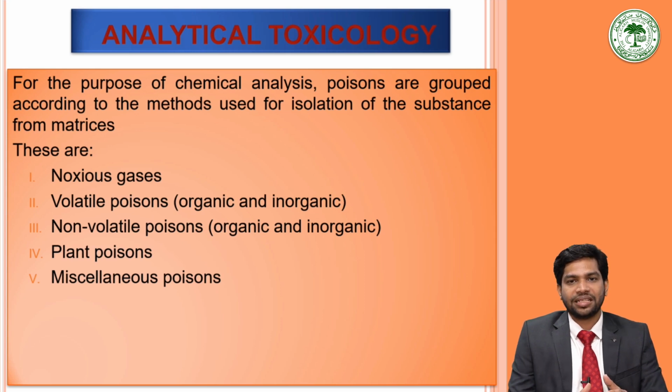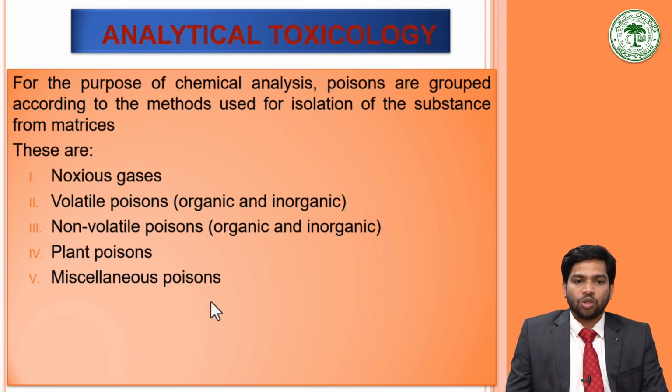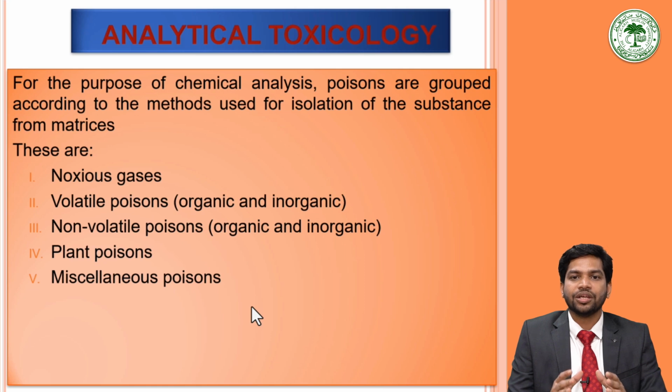There, the main challenge for the toxicologist is the extraction of the poison or the drug from this large bulk of the tissues that are sent along with the poisonous content. So, the first step before analyzing the poison is their pre-treatment and extraction from the unnecessary tissues.